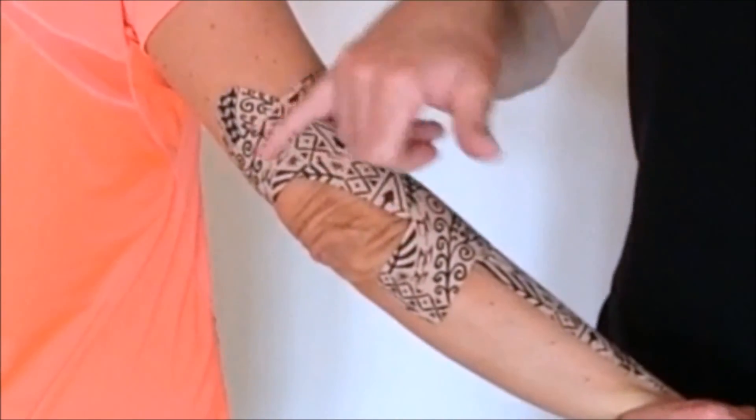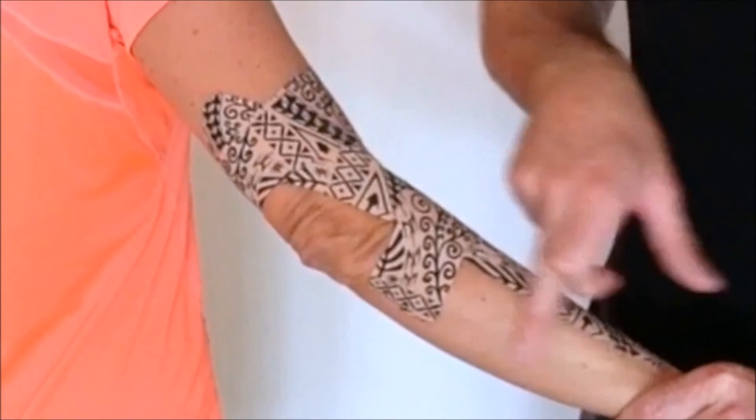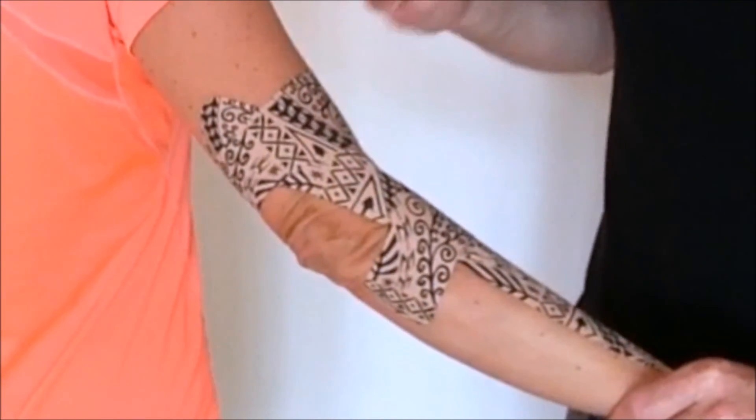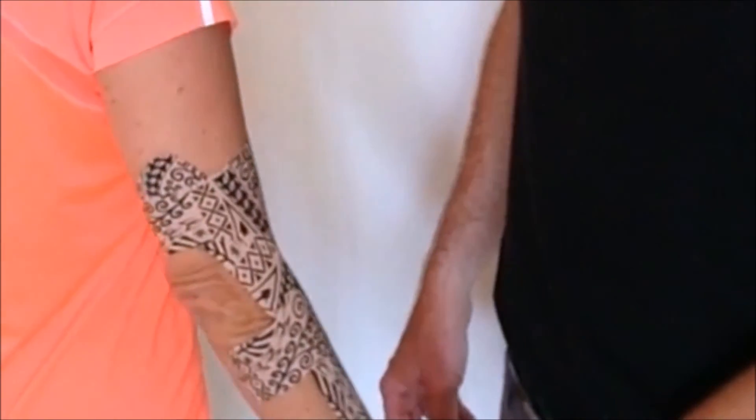Here we can see how effectively that's boxed up all of that soft tissue. If we compare what's happening down here to what's happening here, it's very, very different — we've really gathered everything together to take some of that soft tissue pressure off.